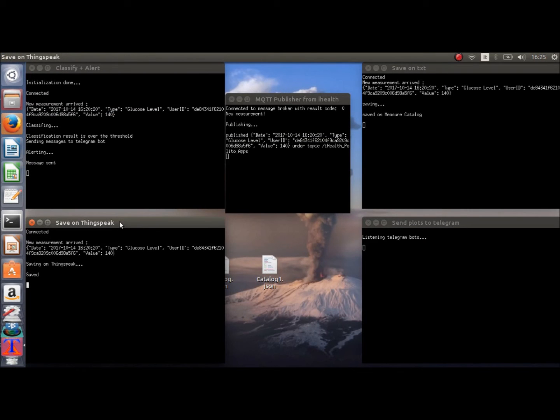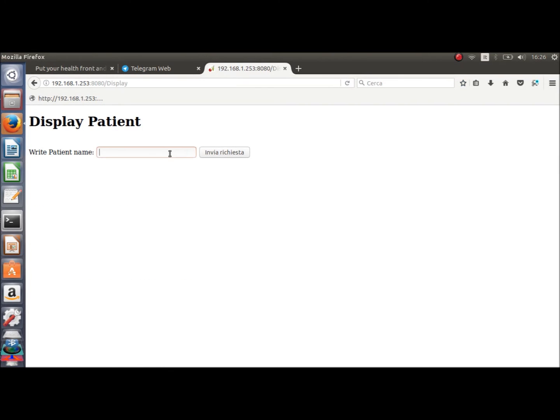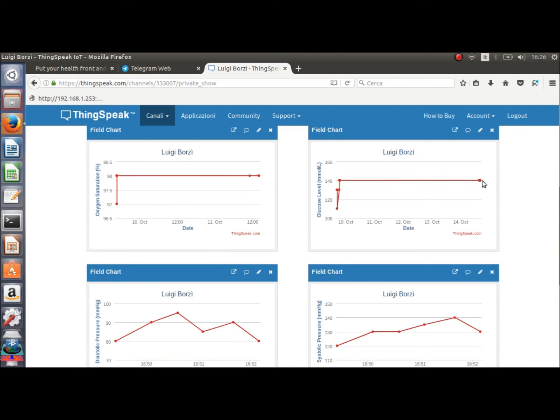The save-on-ThingSpeak microservice updates the right ThingSpeak channel via MQTT communication. We can check by using the web service, clicking on the option Show Patient Data, writing the patient name, and checking it. This is it.